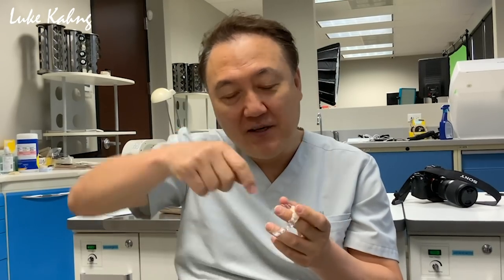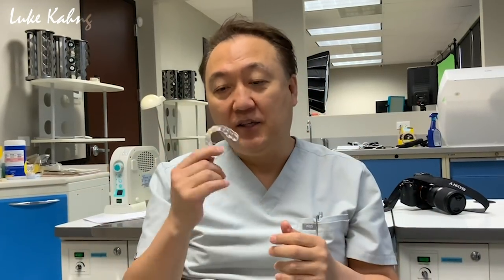Now, another question is they ask, can we wear it at nighttime? Yes, you can. You can take it out and clean it up. And the other thing is the doctor can reline it, because whenever they pull out the teeth, they have a big hole. So we're trying to make it convex, so the doctor can make it convex, so the cleansability is better, and then the healing of the tissue area.